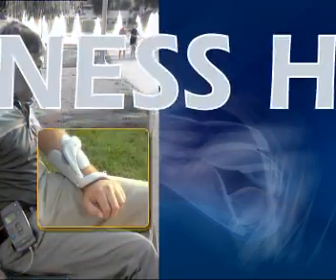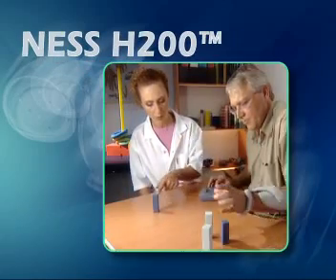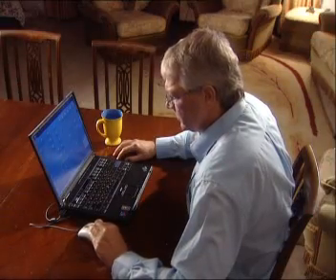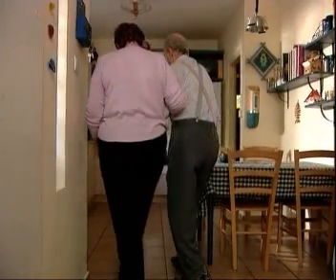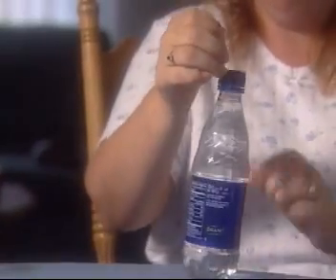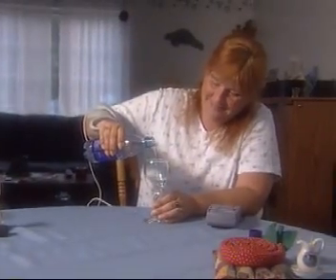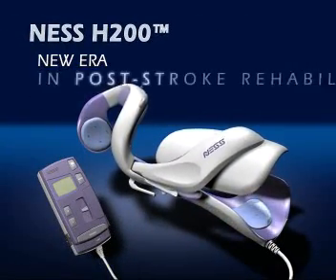Technologically superior and ergonomically advanced, the Ness H200 optimizes session time for patients and clinicians, accelerates rehabilitation, and promotes independence and self-confidence. For the millions disabled from stroke and other central nervous system injuries, the road to rehabilitation and return to normal life is long and arduous. The Ness H200 system provides the much-needed assistance on this difficult and costly road — a major technological breakthrough defining a new era in post-stroke rehabilitation.